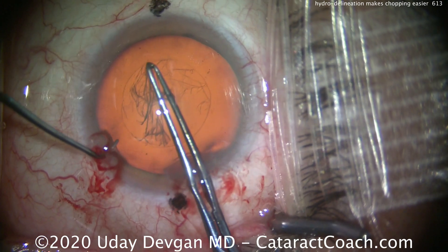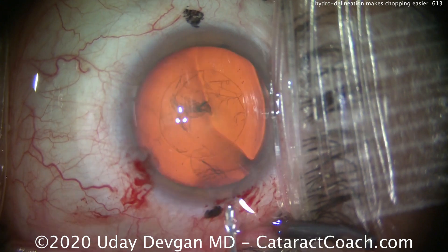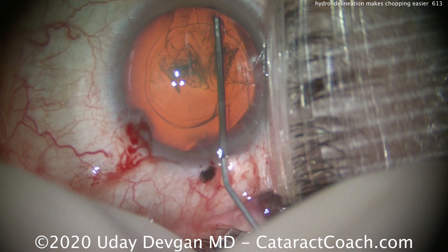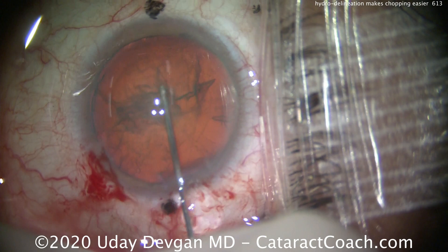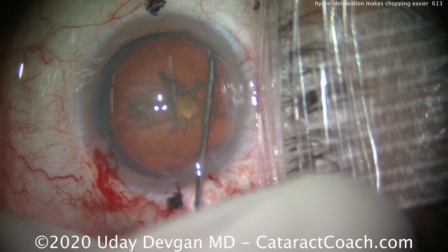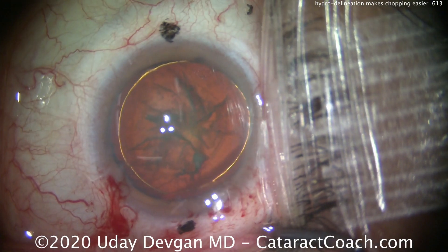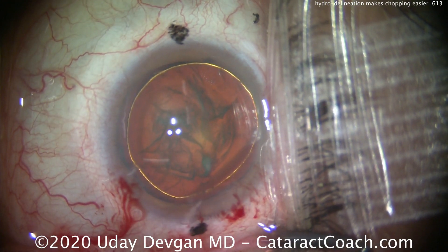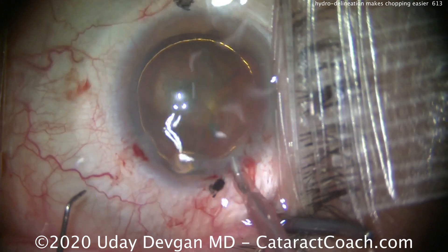But if we do hydrodelineation, that separates it out and creates a smaller endonucleus of maybe 7mm diameter. So watch carefully — there's our hydrodissection and hydrodelineation. There's the golden ring of hydrodelineation. Now that central endonucleus is smaller in diameter. The part within that golden ring is now only about 7 or 7.5mm diameter.